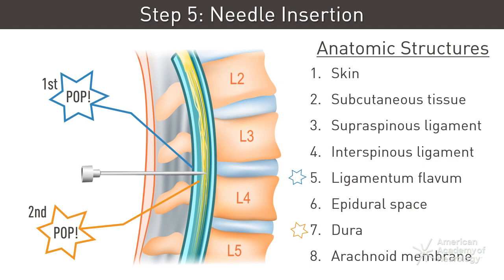Needle advancement should be slow so you can feel for two pops, with the second pop typically indicating that you have crossed the dura. When you feel the second pop, withdraw the stylet fully and watch for a few seconds to look for CSF return.